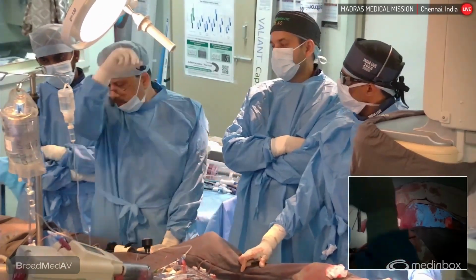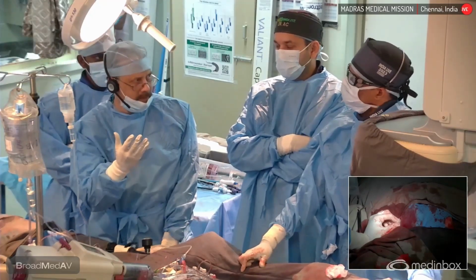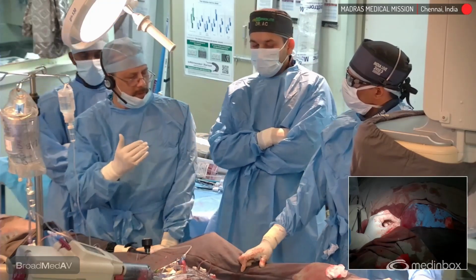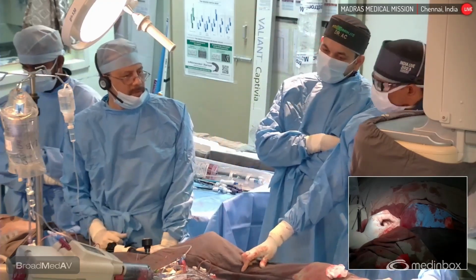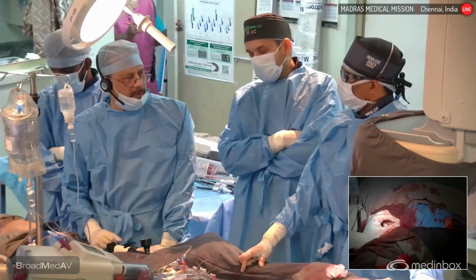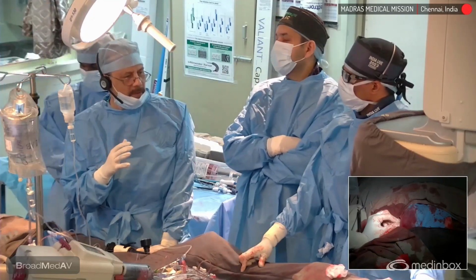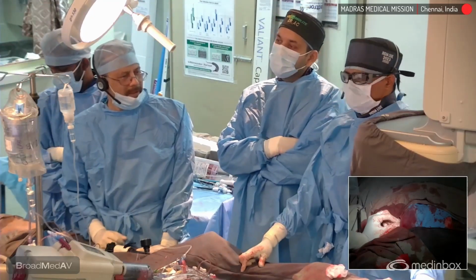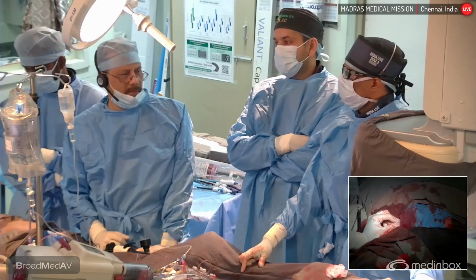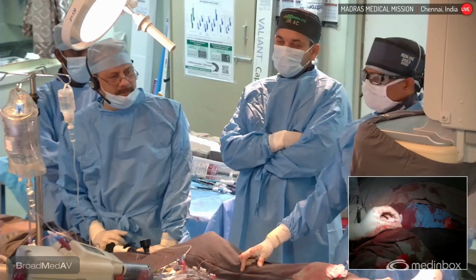Usually we puncture a little above so that you can place the covered stent above the bifurcation. So anatomically that should be possible. Only then we can put a covered stent. If you have to bring it down into the profunda femoris, that's not possible. That is why we always puncture 10 millimeters above the bifurcation. If we have a puncture 10 millimeters above, then covered stent is a possibility. Usually in very elderly persons you can do that, they are not going to flex their joint actively. But in a younger person, I would prefer surgical repair.